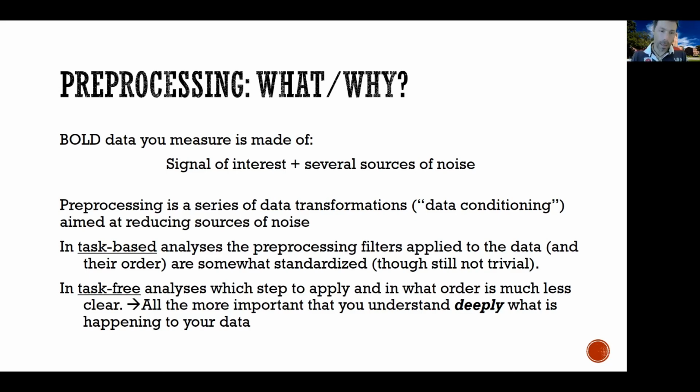But overall, software do implement a fairly standardized pipeline, although different software might implement slightly different pipelines. Now, in the context of task-free analysis instead, which steps to apply and the order is actually much less clear and much more debated. And this is why it's so much more important that you understand in depth what each of these preprocessing steps is doing and how it's changing your data.